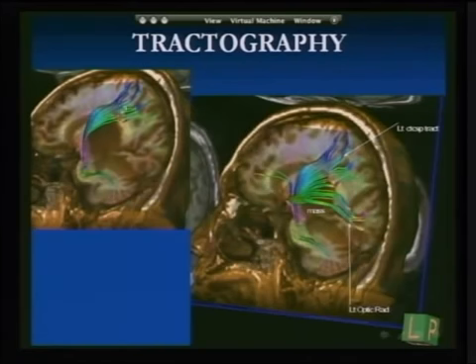On the sagittal, this is the corticospinal tract, the mass, and here is the nicely demonstrated optic radiation reaching the occipital cortex. Actually, the mass was attacked from the middle between both of them.